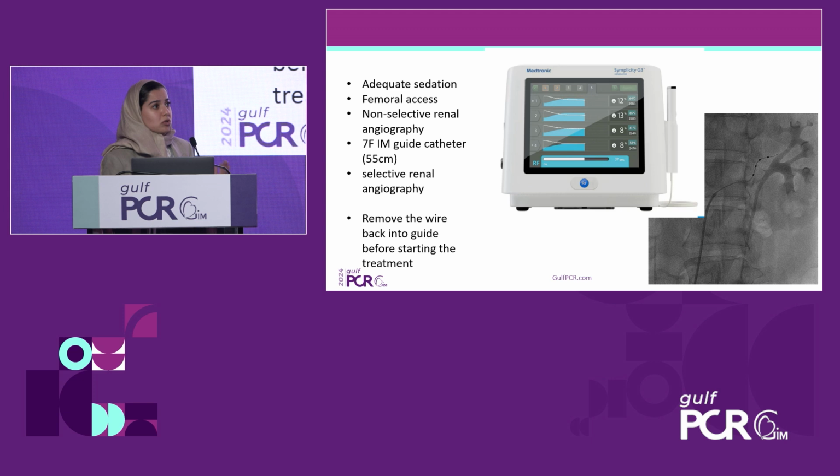And the idea is that you don't treat the same segment twice. So with these particular catheters, it gives you the variety of actually treating different segments without having to do an overlap or treating a segment twice.